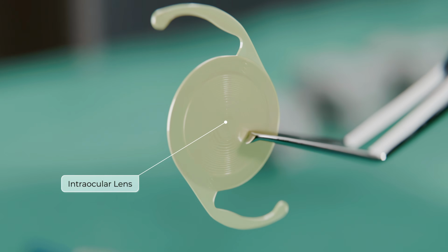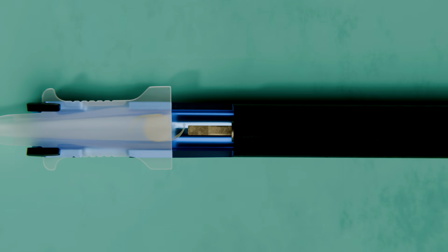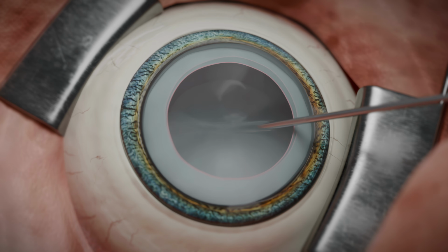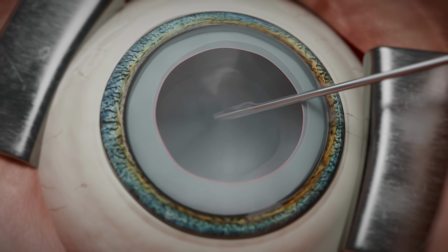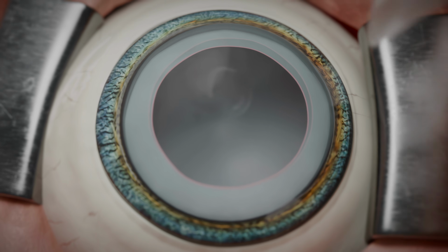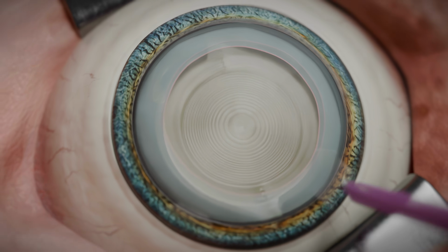A posterior chamber elastic intraocular lens is implanted using a cartridge pre-filled with viscoelastic. The soft elastic intraocular lens is then loaded into the cartridge. At this stage, the capsular bag is filled with viscoelastic. The intraocular lens is implanted through the tunnel incision. After implantation, it is centered within the capsular bag under visual control.